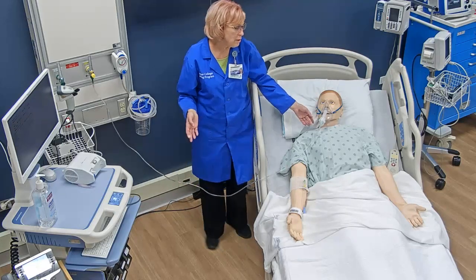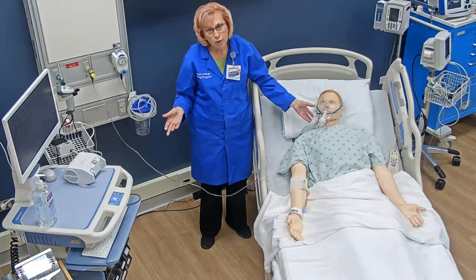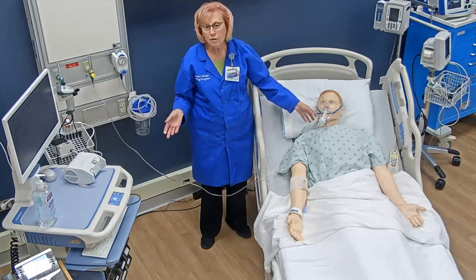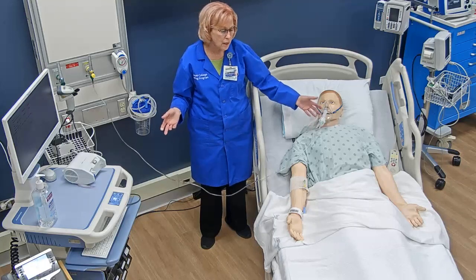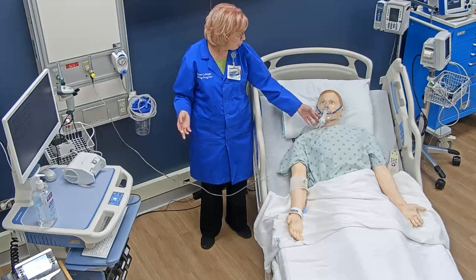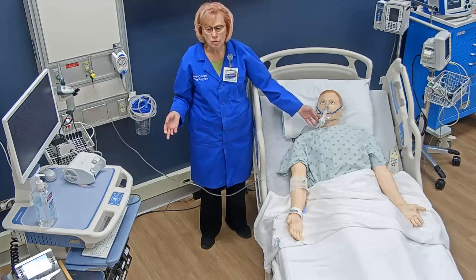How long this takes depends on the medication and the volume of the medication. So this was 3 milliliters. It'll probably take about 10 or 15 minutes. Sometimes patients get several different medicines all together. It might take 20 minutes. It depends on the medication, and on how quickly it's being delivered to the patient.